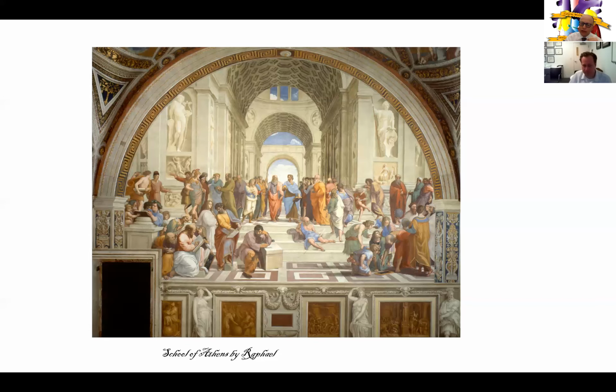Thank you. The second question I have before I let you go, I know we imposed a lot on your time during these busy times, is how much have you seen, at least at our center here in Cleveland, a shift in requests for CTA for this indication from TEE to CT? I know it's very hard to quantify, but have you seen an increased demand to avoid doing TEEs in the era of COVID, in the era of limited testing for COVID-19? Have you seen at least a different pattern of practice?